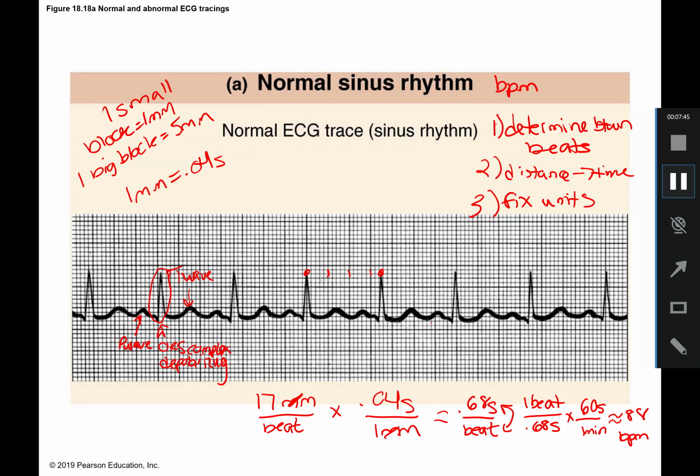Or maybe the heart is engorged and the signal is taking a longer time to travel. Or if your heart rate is too high, well, maybe you're just exercising, or maybe you have some sort of cardiovascular abnormality and something's wrong. And so by looking at both the intervals and heart rate, we can use them to help us assess the cardiovascular function of our patients.